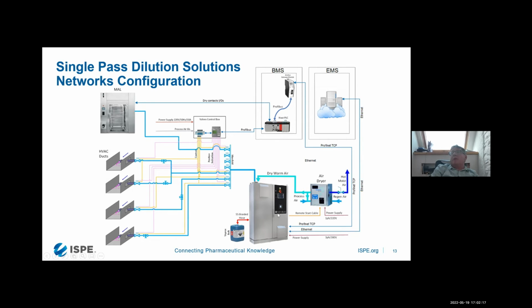The system is bringing reports, alarms, and the audit trail back to the building network for the data collection.